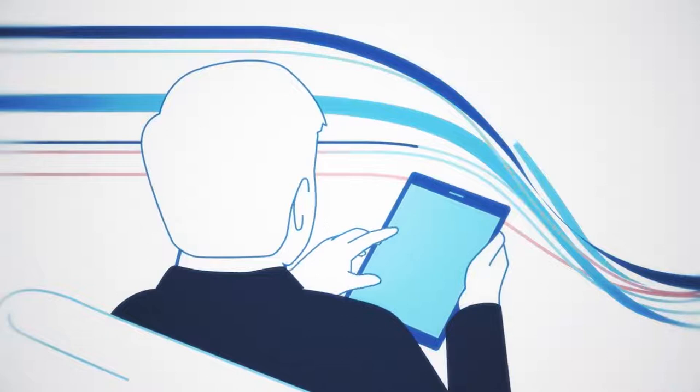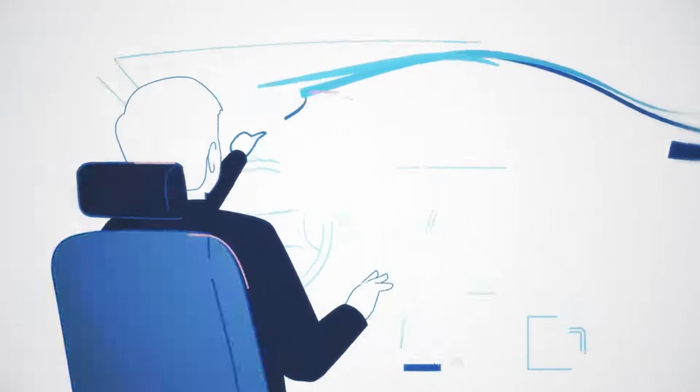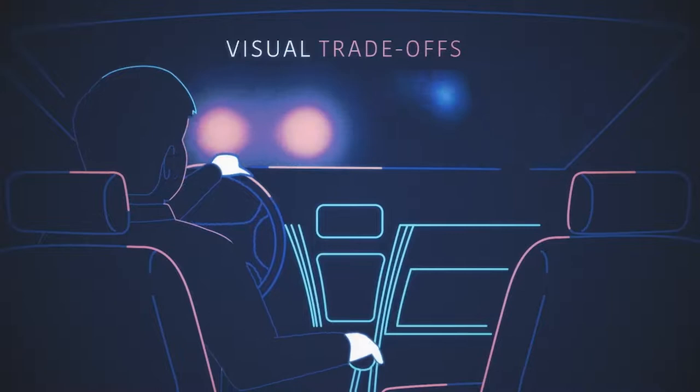Presbyopia-correcting intraocular lenses offer a beneficial alternative for active patients who rely on a broad range of functional vision to address the visual demands of everyday activities. However, some patients are unable to tolerate the potential optical disturbances, such as halos and glare.